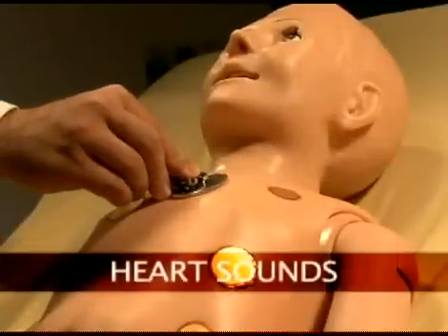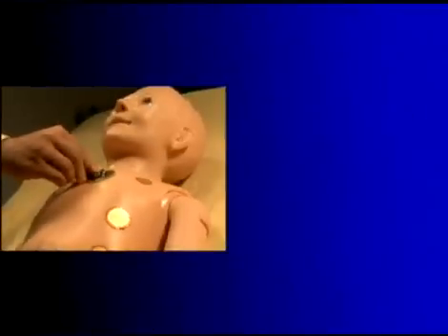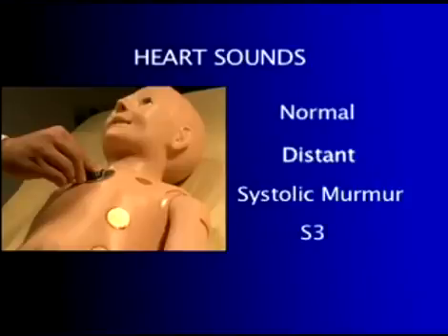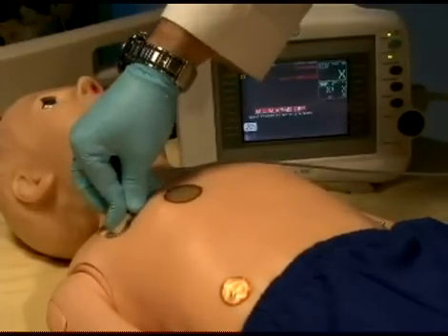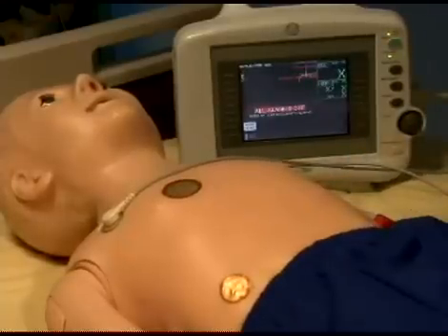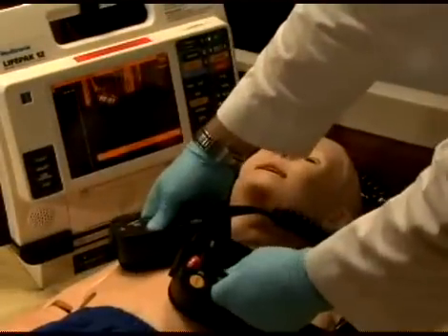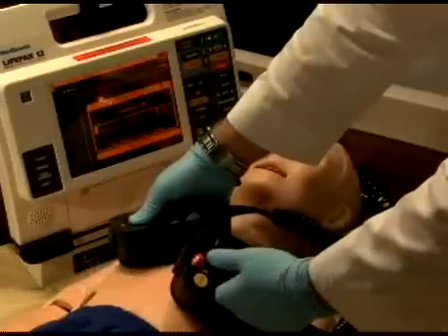Pediatric HAL is equipped with several realistic heart sounds, which are tied to a user-defined heart rate and selectable rhythms. This feature permits the user to track cardiac rhythms and other events with their own equipment, just like with a human patient. Pediatric HAL can be shocked or paced with real energy for cardioversion, defibrillation, and pacing drills.